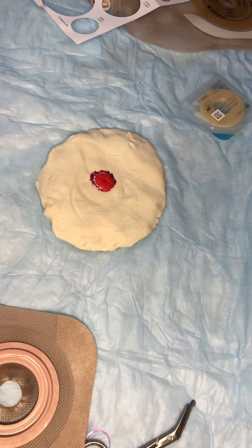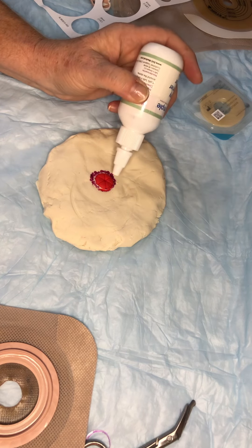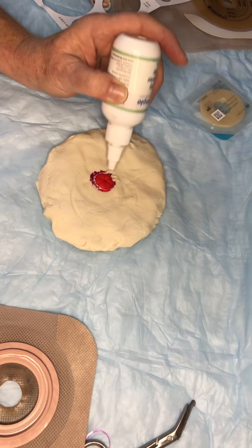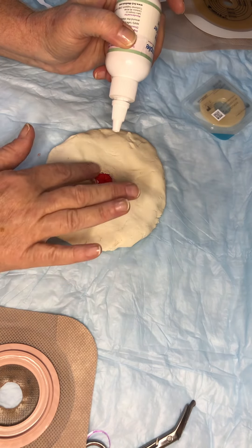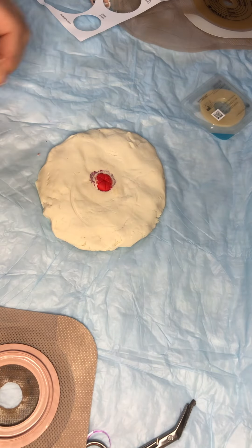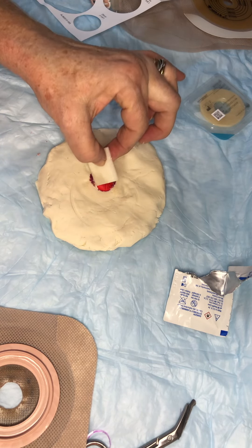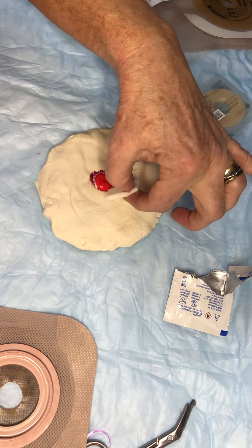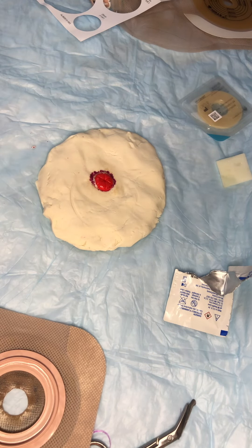So I'm happy with that. What I'm going to do now is go ahead and treat this whole area that is irritated. You're just going to lightly powder all around here, spread it out, get it all in there nice, maybe wipe off the excess. Then I like to take a tiny little barrier wipe and go all the way around and dot it, so you're making kind of like a crust - that's why they call it crusting.